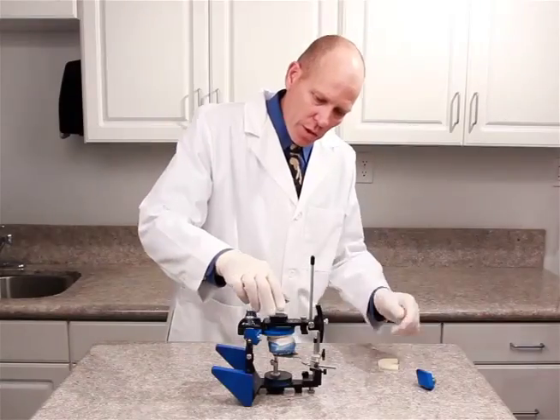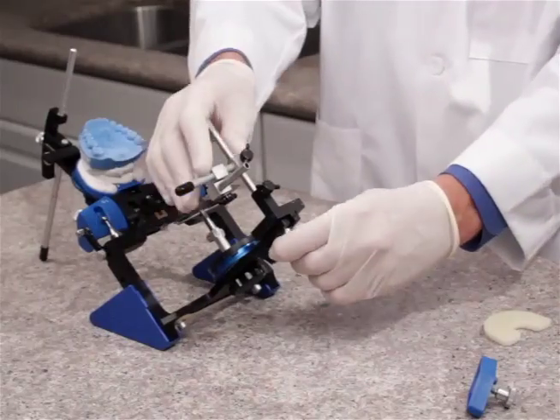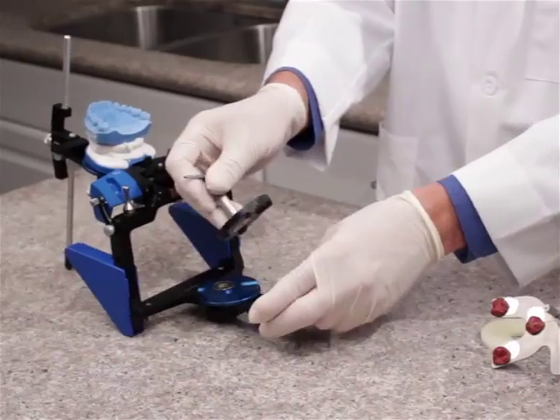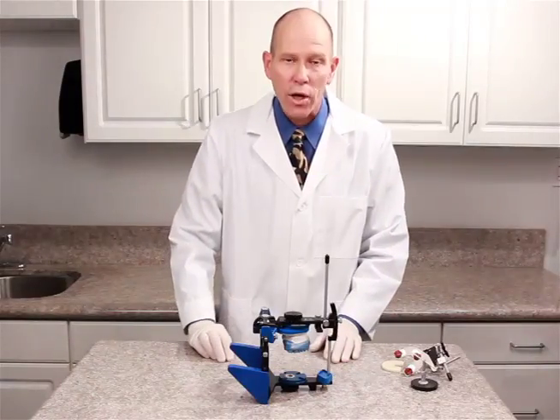The plaster is now set, so we can go ahead and swing this open. We can remove the bifork assembly along with the mounting fixture, replace the incisal table, and then remove the bifork support system. We can now go ahead and prepare for mounting the lower cast.